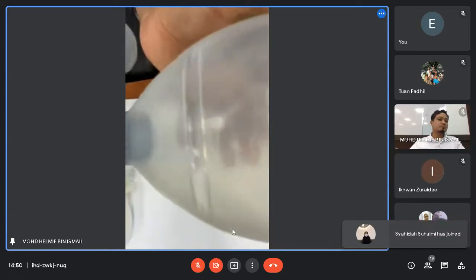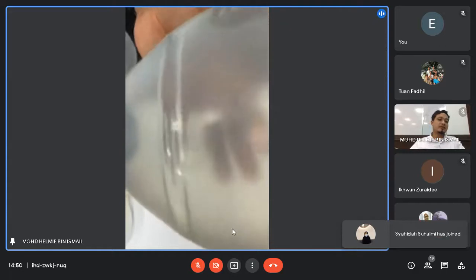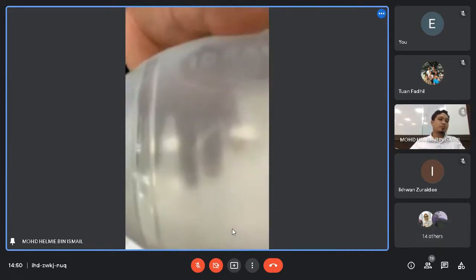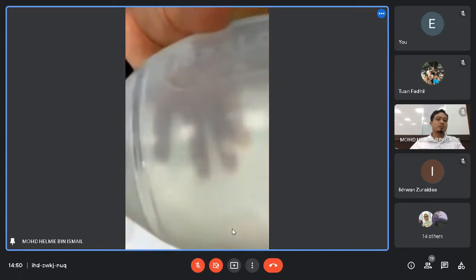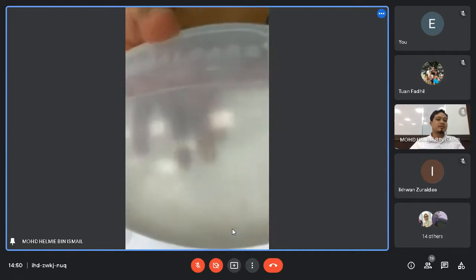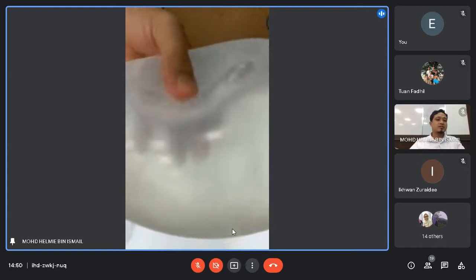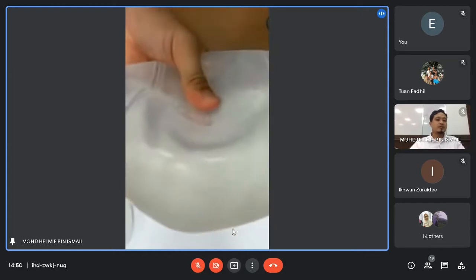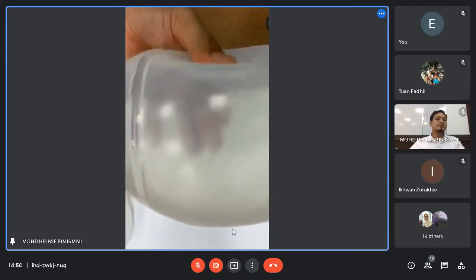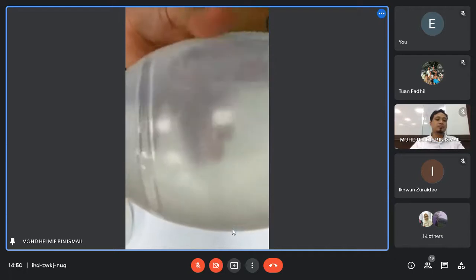One tidal volume, the maximum basically you give about 500, right? So you need to give 1/3 lah from this volume. So basically kena macam tu je, jangan rapat sangat, right? This is the correct way lah, jangan rapat macam ni. Kalau you rapat macam ni, you tend to give about 1 liter. Basically you need to give 1/3 from this volume. Macam tu je.